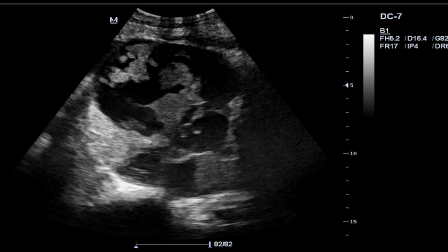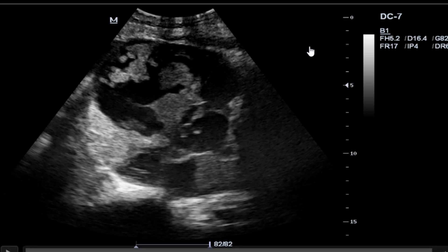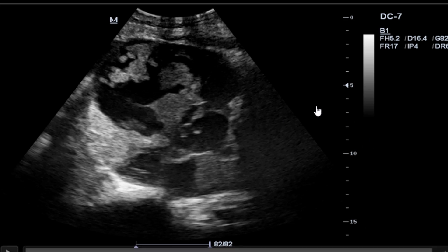On ultrasound examination, these are the sonographic findings. You can see in the right adnexa there is a complex mass, and it was not distinguishable from the right ovary, meaning it was most likely ovarian in nature. Examining the lesion, you can see that it had internal solid components — echogenic internal solid components.